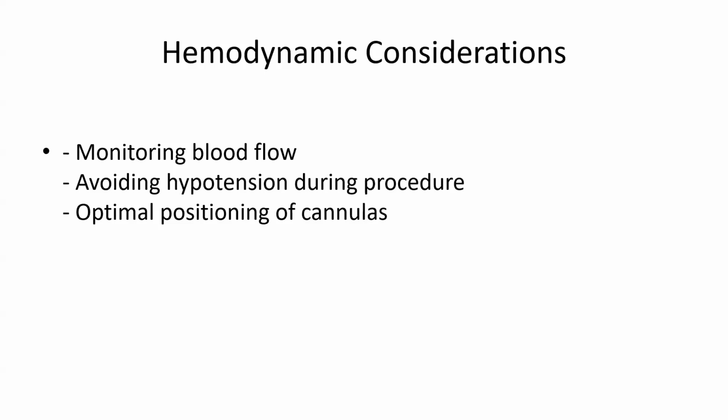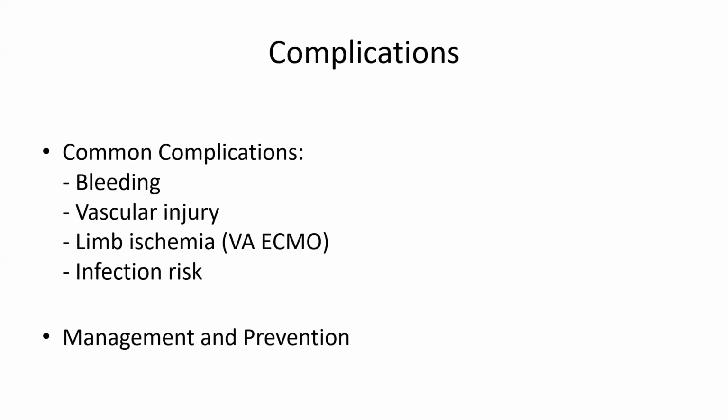When we are cannulating, always remember that the patient may be hemodynamically unstable. So a couple of people should be taking care of the hemodynamics of the patient. And after we have put the cannulas in, its proper positioning has to be ascertained by ultrasound, by echo, or your X-ray. What are the common complications that we find?